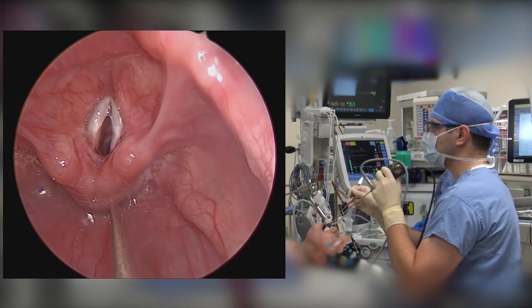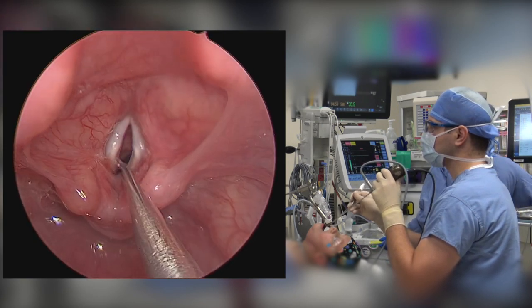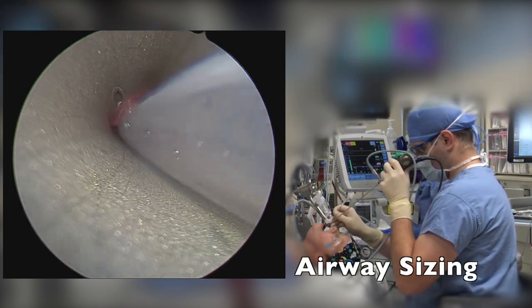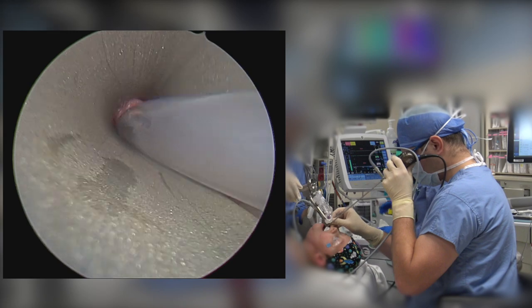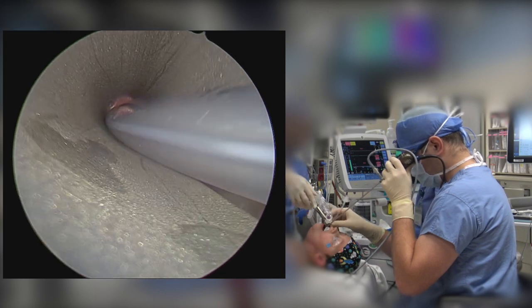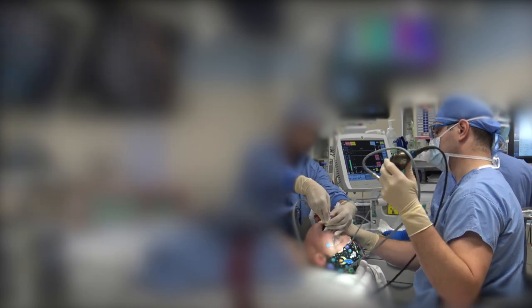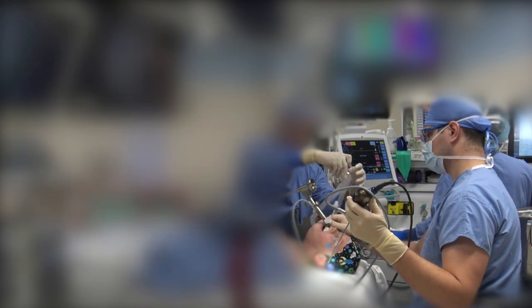Secretions can be suctioned to optimize visualization. Here we are going to be sizing the airway using standardized endotracheal tubes, which are then connected to the anesthesia circuit.